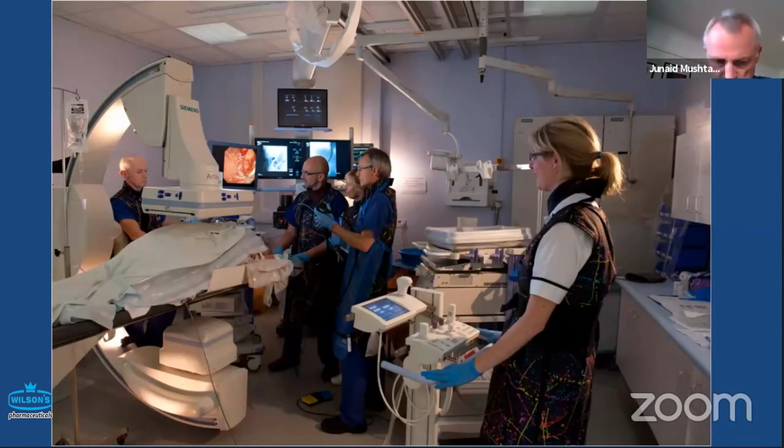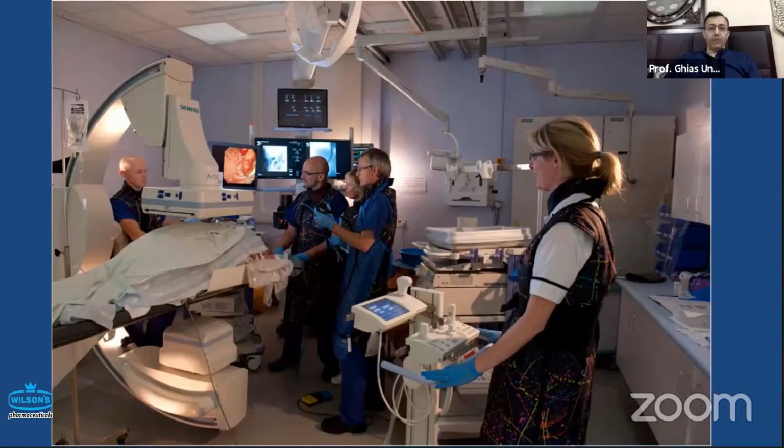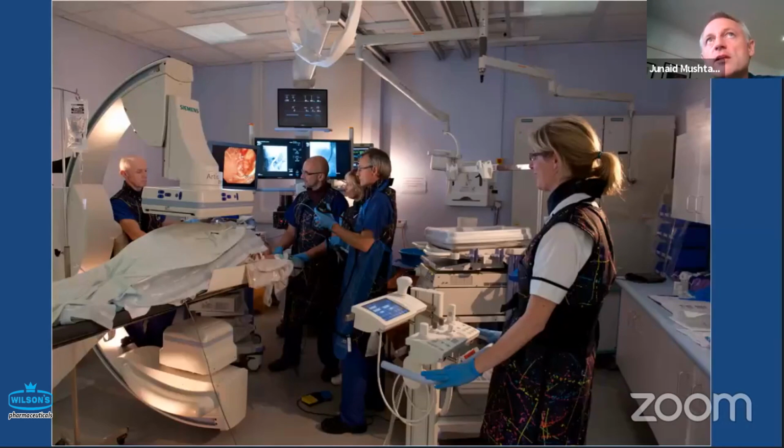Right, there's another question: what is your policy in terms of antiplatelets and anticoagulation, and when to say no to ERCP? Yes, that's a good question. If a patient is in multi-organ failure, they are coagulopathic, and you're asked to do an emergency ERCP, you may not have a choice. You may have to do it there and then. If the multi-organ failure is deteriorating every hour, then you really don't have time.